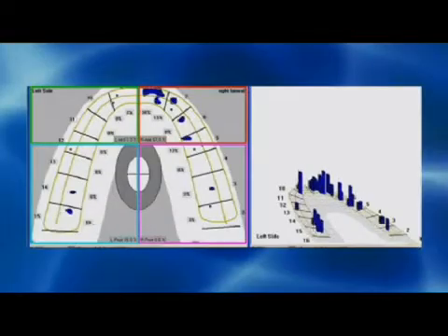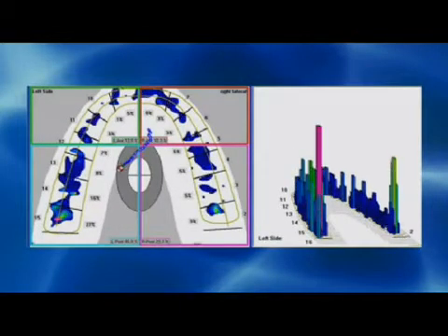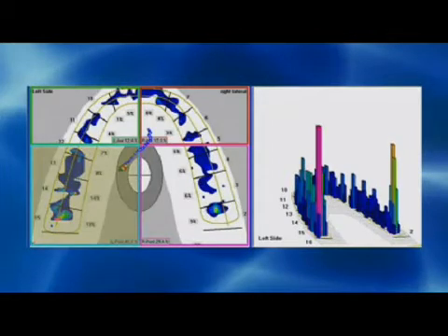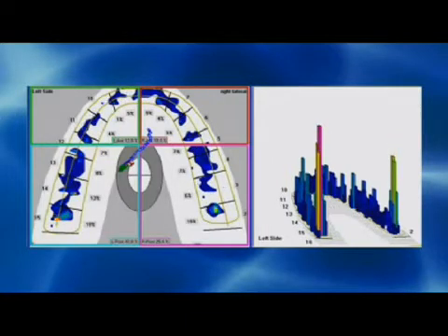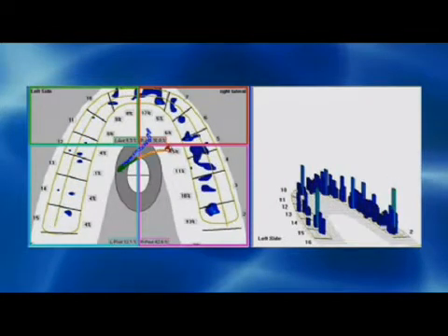Okay, Caroline, let's look at the recordings. This is of you moving to the right, and first, when you close your teeth together, your bite is fairly uniform until the left posterior teeth become extreme, and that happens before the right posterior teeth become extreme. So there's an imbalance in your closure that is predominantly to the left side. You have significant imbalance to the left side. So here, when you're moving to the right, you'll see that your back teeth stay together on the right side and on the left side. And then as you try to move further to the right, you actually have a worsening of the left side.